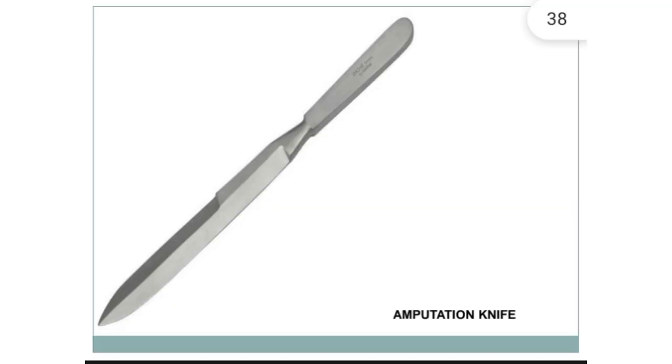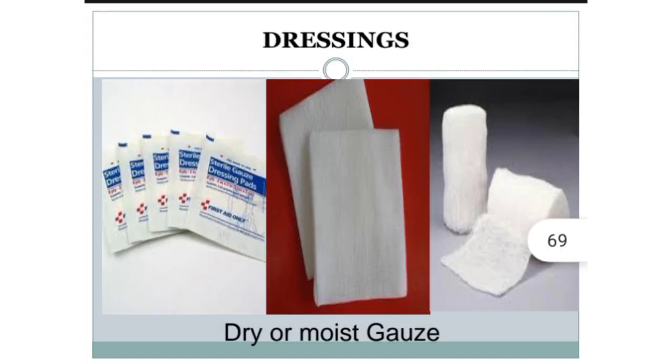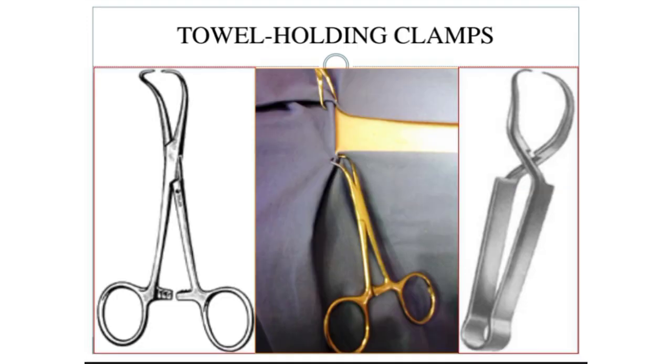So this is an amputation knife. From the name amputation, it is used to amputate, cut out a part of the body. As you can see, it is longer than a surgical blade, and the handle is different from a Bard-Parker handle also. Okay, so it is used to cut out a part of the body, maybe due to cut of blood supply or something. So these are gauze, dry and moist gauze.